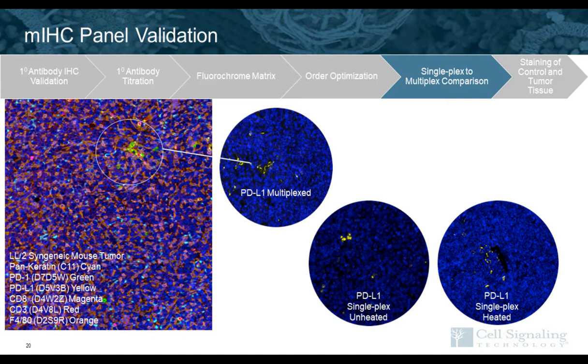So once you have your panel to a point you consider optimized, it's important to compare the staining in the full panel to both a single-plex stained slide. Or sorry, let me start over. This is an important slide, and I want to make sure that we cover it.